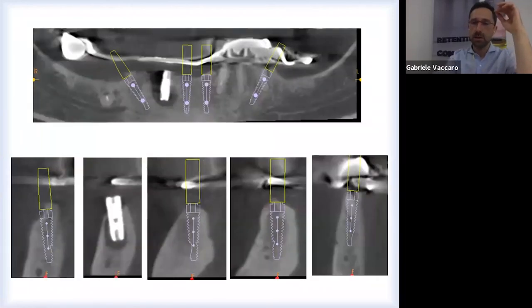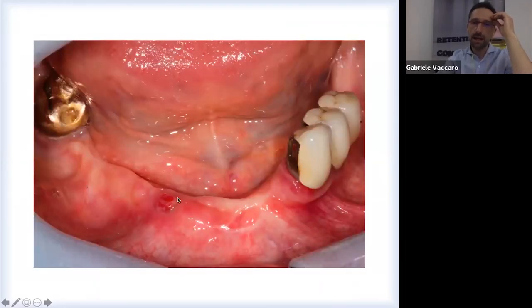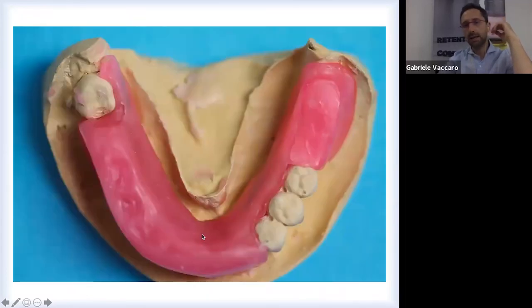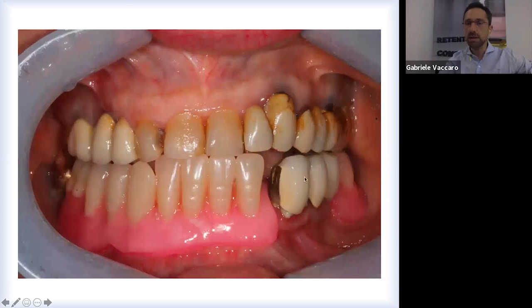In this case, the patient came with this removable prosthesis and a failed implant above here. We removed this failed implant and placed 4 new implants. And the steps are always the same. First of all, we have to find a vertical dimension here. This part was completely moving, so this doesn't count. This is not a fixed reference point. We started with a new reference point, like this, exactly.